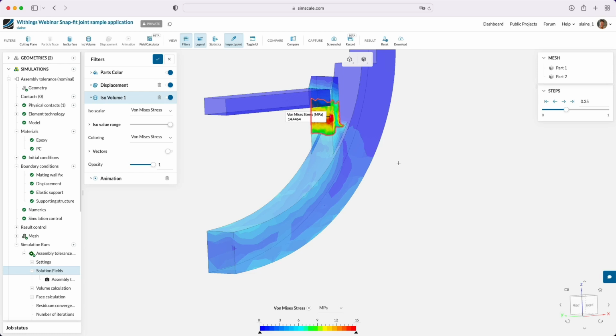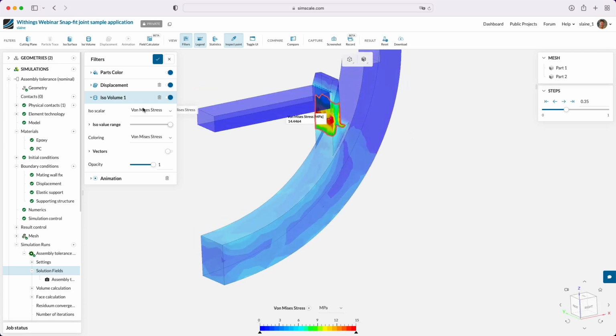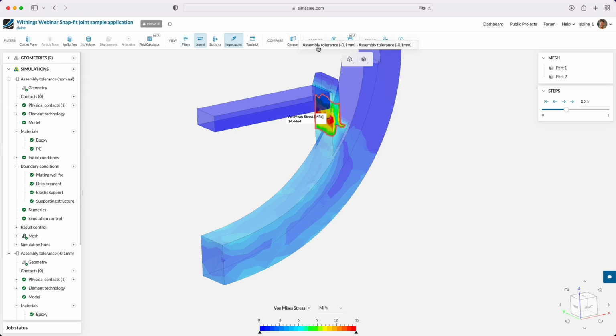So the thing that we want to look at here is if we've got maybe a minimal tolerance, so a worst case scenario for the stress of this clip, where the part is slightly smaller than it should be, and we've actually got these two parts closer together, what's the stress going to be in this actual clip? So we can have a look at that by comparing the assembly tolerance directly with this one that we've analysed here as well.